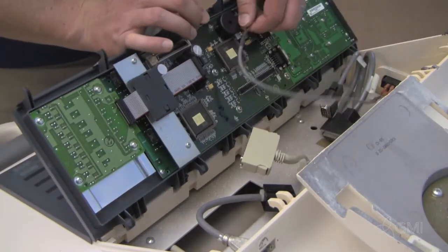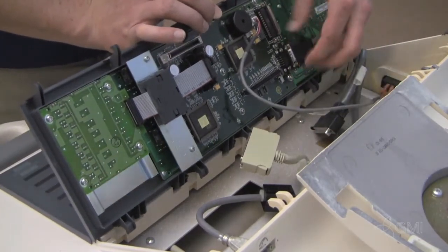Reinstall the upper UI by inserting from the bottom. Then reinstall all cables and tilt down.